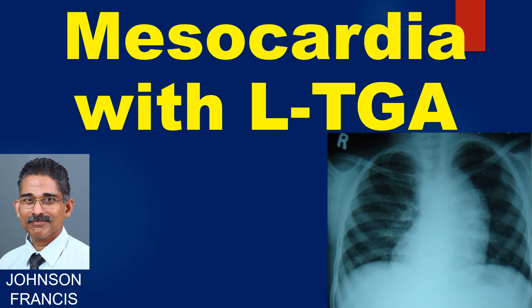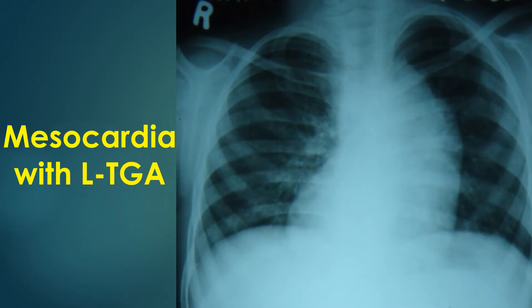This is a discussion on mesocardia with levotransposition of great arteries on chest X-ray. The X-ray chest PA view shows mesocardia with LTGA, and the L-posed aorta is seen as a bulge along the left upper border. The cardiac shadow is seen in the midline with almost equal spread to either side, suggesting mesocardia.